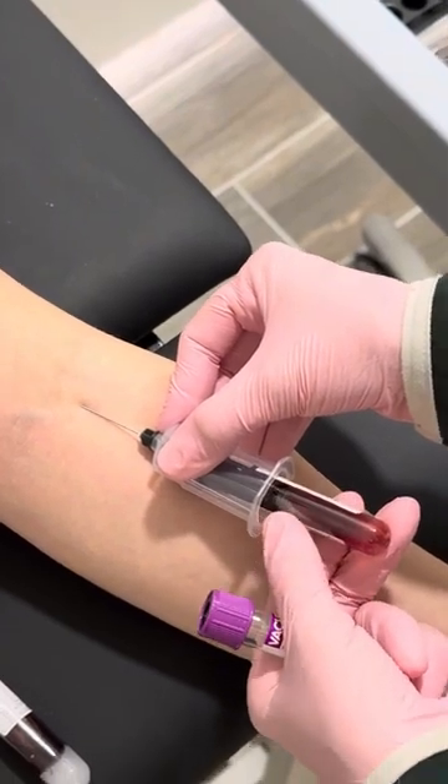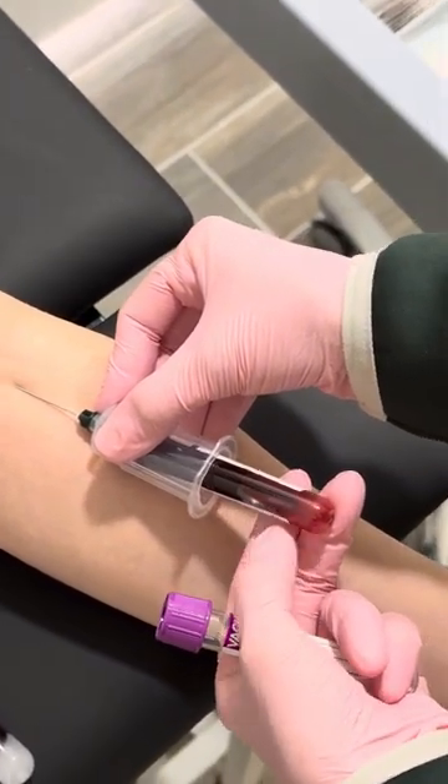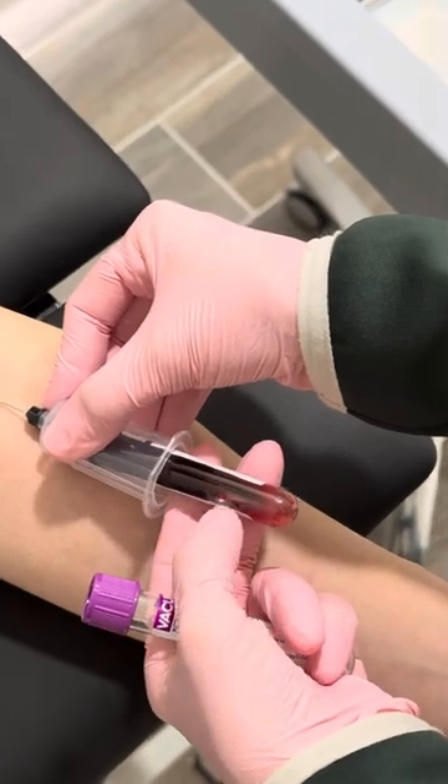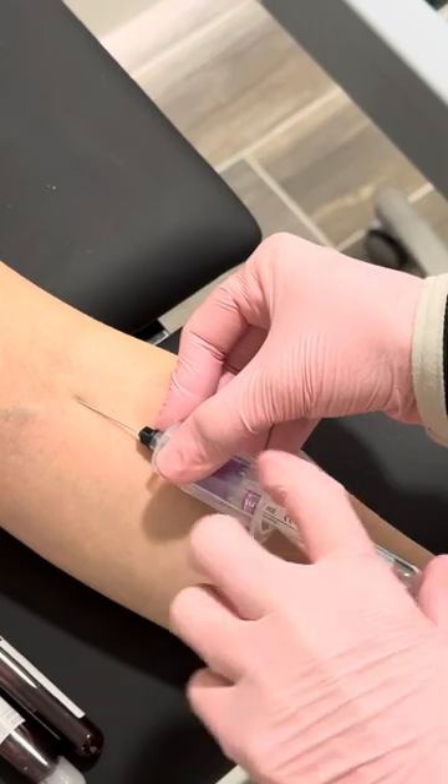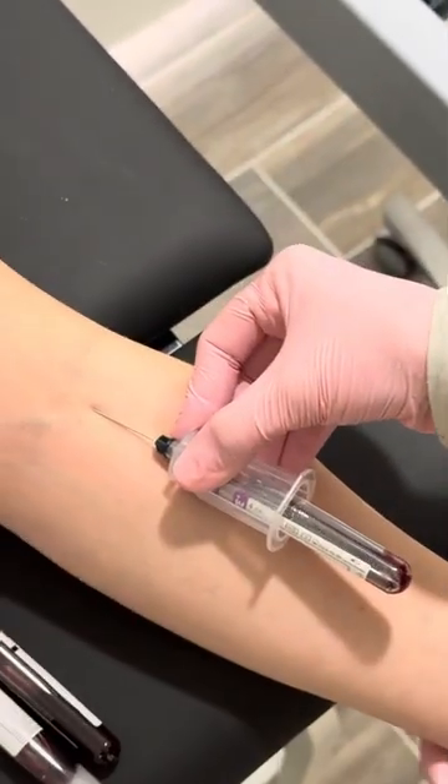You can see your blood filling. Once it stops, pull it out. Make sure you have a good anchor on the arm.